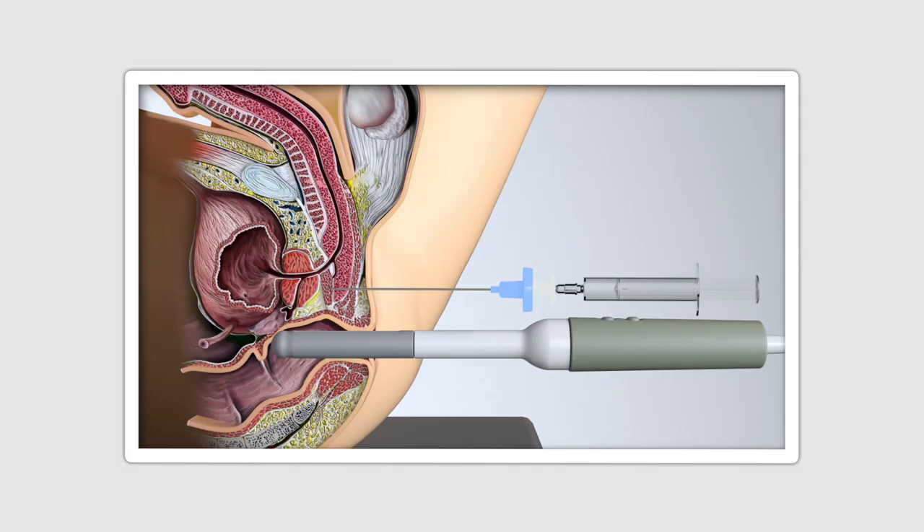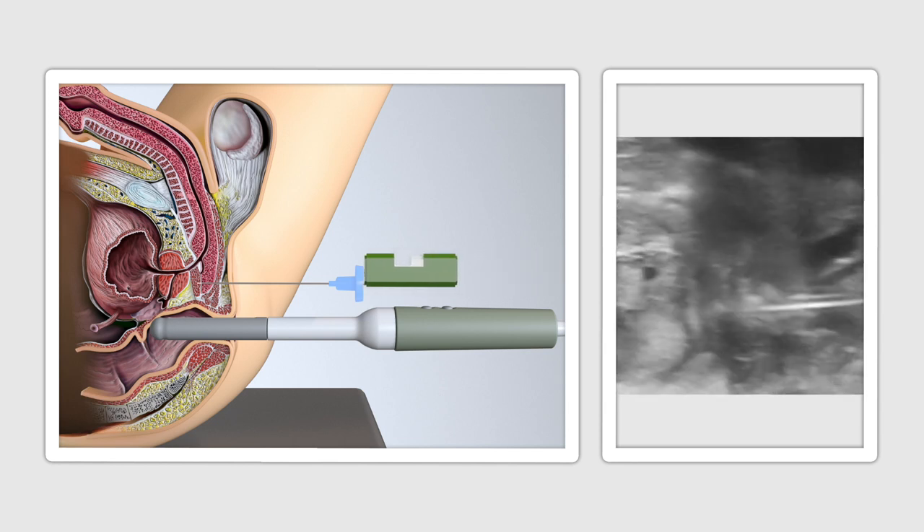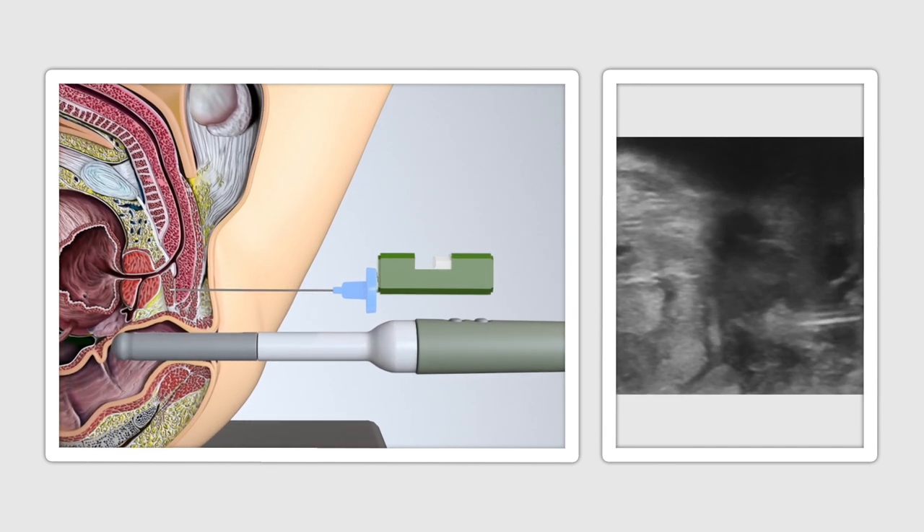Once the cannula is placed just adjacent to the apex of the prostate, some further local anaesthesia is inserted at the apical junction. Once deployed, the syringe and inner delivery needle is removed, leaving the cannulation probe ready for prostate biopsies. A standard 18 gauge biopsy needle is inserted through the cannulation device with no need for any extra insertion points.